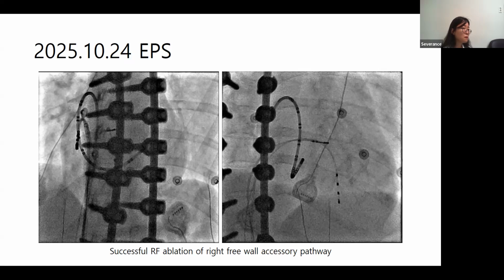So I think the short is much better. SR1 is proper for this position. I think so. SR1 or SL1, it is okay. But nowadays we can use different sheaths.